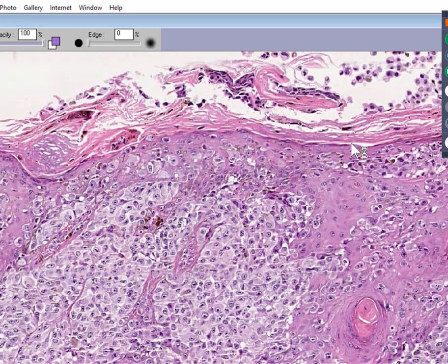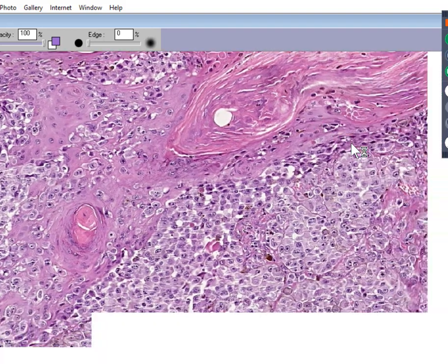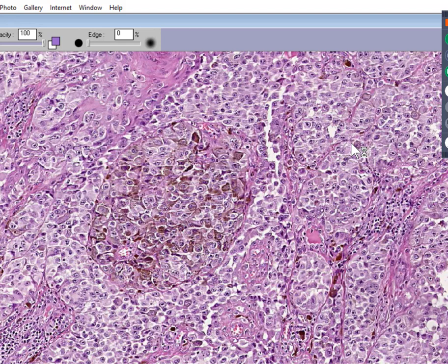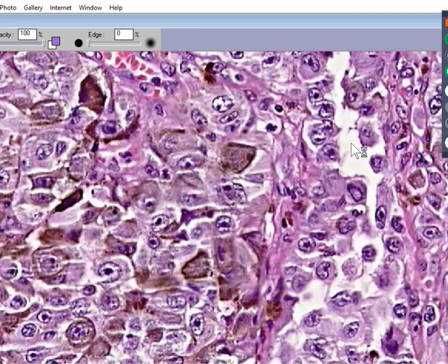Even the cells that are part of the tumor may look somewhat pigmented. There's a bunch of pigment there and there and there and all over the place. So we could see that there are nests of tumor cells invading into the dermis, and they also happen to be pigmented. And they also happen to be ugly or nasty because they're big, they're dark, they have prominent nucleoli. And look, many of these tumor cells are loaded with this golden brown pigment.